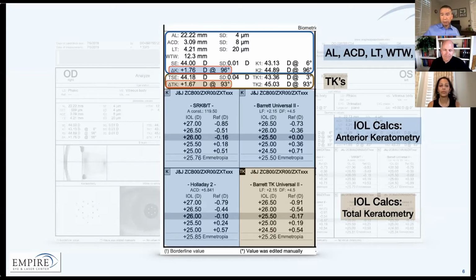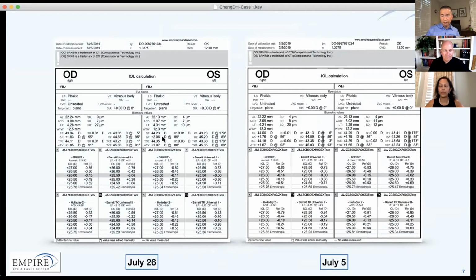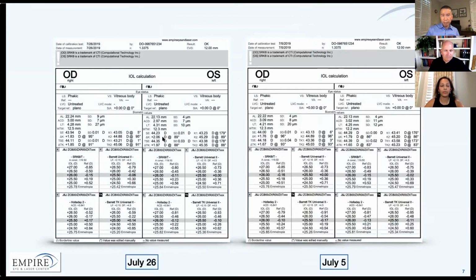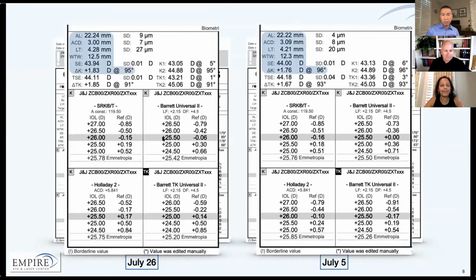So it's a nice single page that gives you, when you break it down, you look at the pictures on the measurement analyze page, you look at the calc page, and as I alluded to, I like to do 2 measurements. So here's July 5th and here's July 26th, just a few weeks apart, usually 1 or 2 weeks apart, that looks at the same measurements. So I have the same numbers. You look super consistent here in terms of axial length, 2/100ths of a millimeter, keratometry within what, 0.06 diopters. The astigmatism is within 1/10 of a diopter, and also for the total Ks.